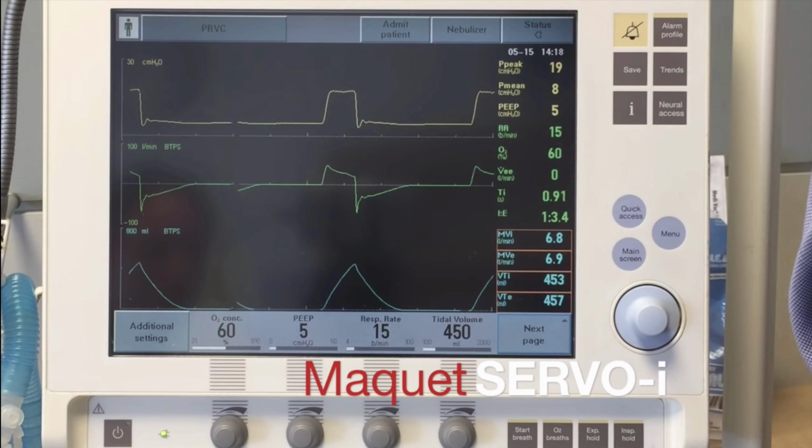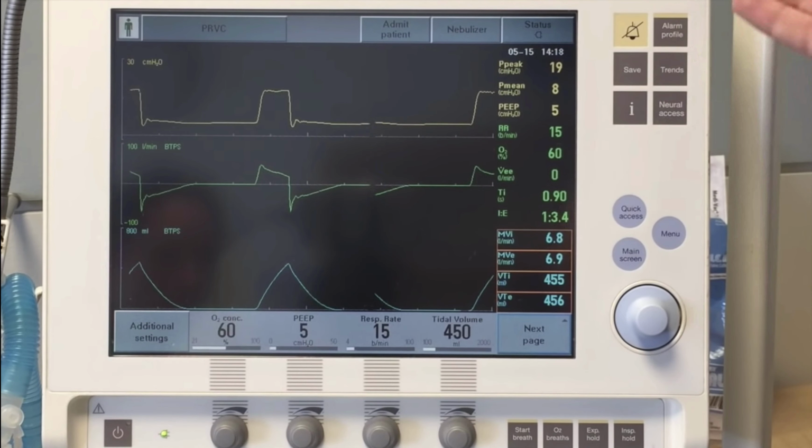What we'd like to do here is give you a tour of the Maquet Servo-i ventilator. This is the ventilator that we happen to use in all of our adult intensive care units here at the medical center. This is a standard setting.